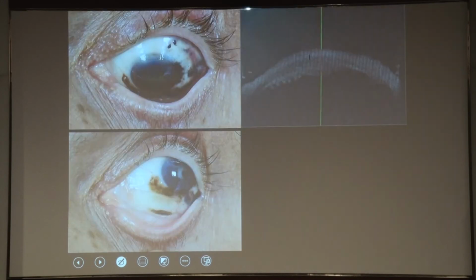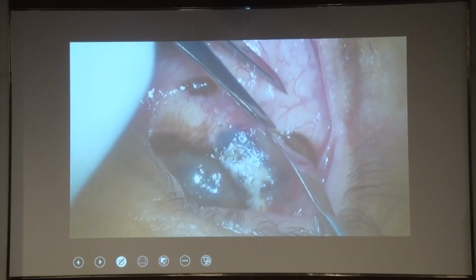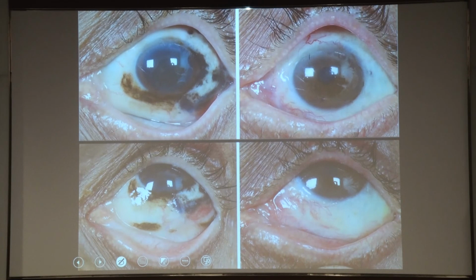Now this is a patient with conjunctival melanoma, diffuse melanoma with, you can see, intraocular extension. These are the ciliary processes that you see. This patient also had good vision and he wanted to preserve his eye. So I'll skip the video. Basically, we excised this and then did what is called rotational plaque brachytherapy. So plaque was applied here, there, and there. Plaque has a particular dimension, so you have to repeatedly apply it to cover the entire base of the tumor. And this was at the last follow-up. He is doing very well.